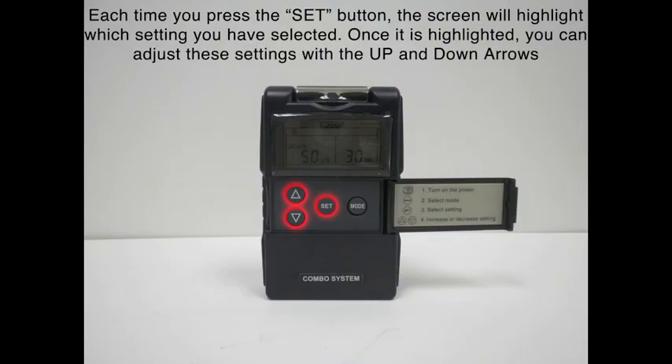If we go back to burst mode TENS, we're going to press the set button. You'll notice that the pulse width is flashing — we can change that with the up and down arrow. If we press set one more time, the rate will be able to be changed up and down. And if we press set one more time, we can change the treatment time anywhere from 0 to 60 minutes.